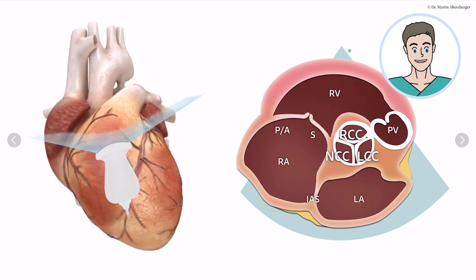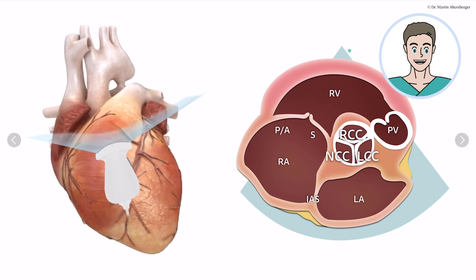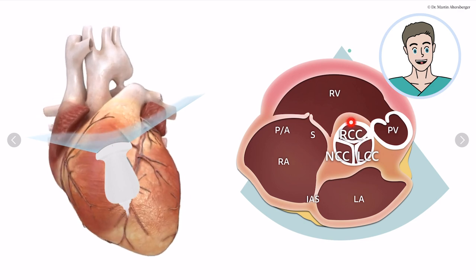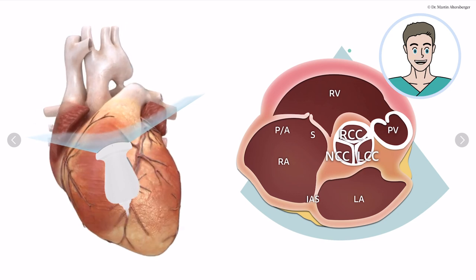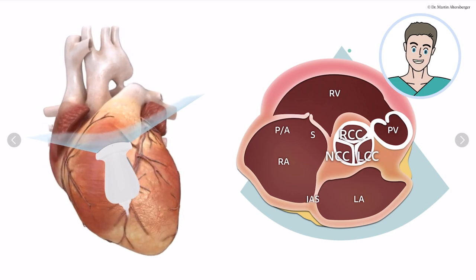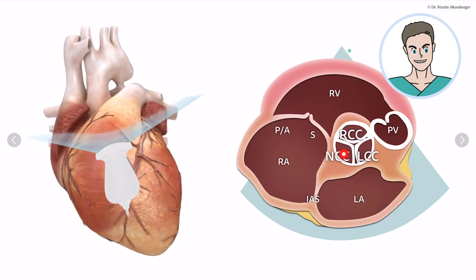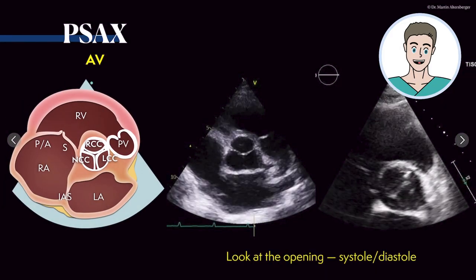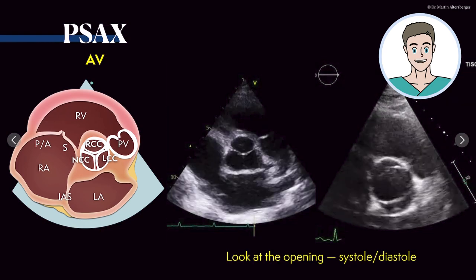Why a parasternal short axis view? With the parasternal short axis view you can really differentiate if there are three cusps. The right coronary cusp always pointing towards the right ventricle, the left coronary cusp pointing towards the left atrium, and the non- or acoronary cusp pointing towards the interatrial septum. So if you have those three cusps you can visualize if there is a normal opening present. Here is an example, and you can also take a look at the compact echocores for the parasternal short axis view.